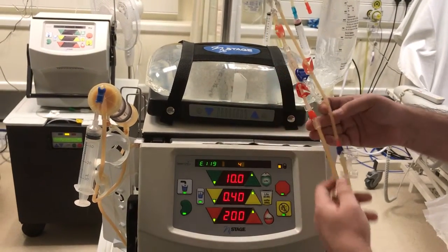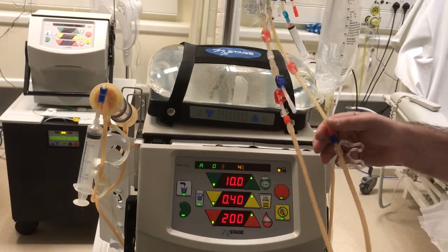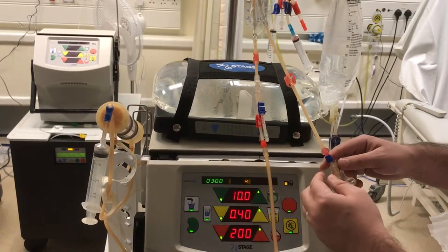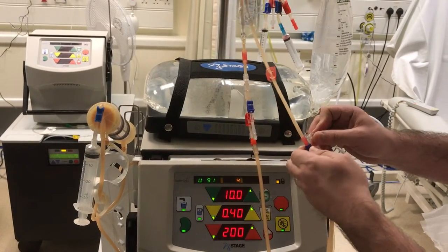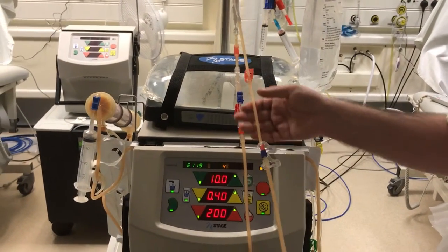Connection. Connect your red to your arterial side, your blue to your venous needle — your venous being your top needle, your red being your arterial to your bottom needle. Once you've made those connections, remember to place your access disconnection on your venous line.